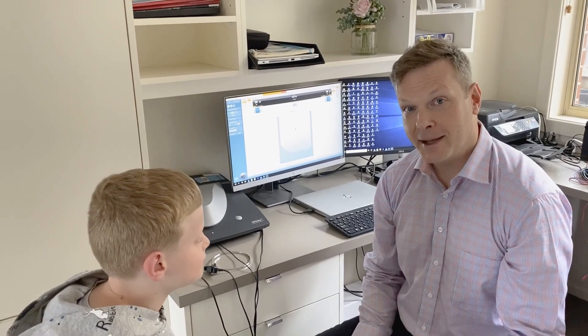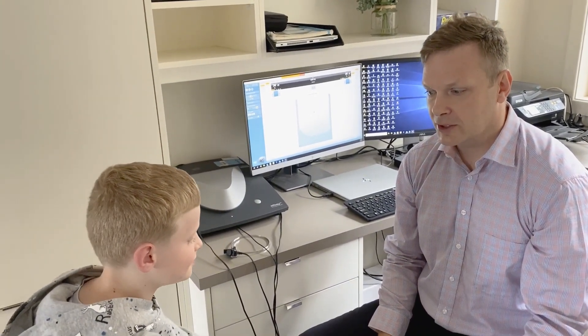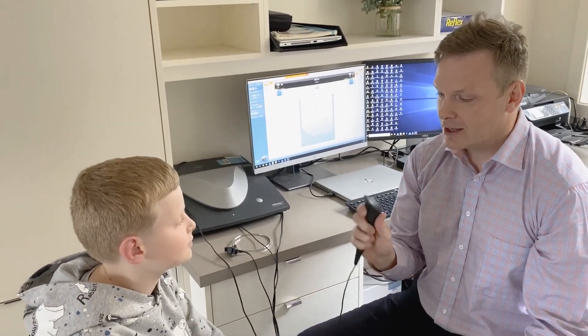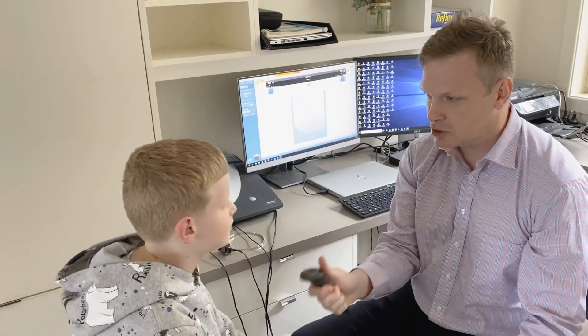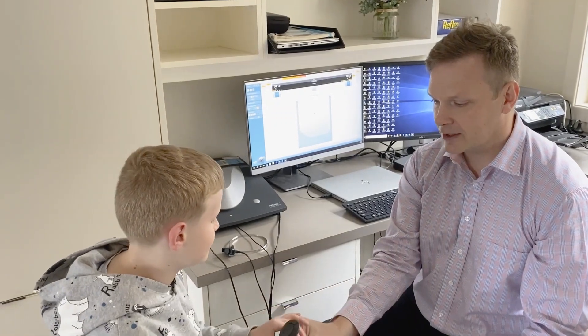Okay, so we've got our patient here. This is Bailey and we're going to do a hearing test today. This is the presentation button — it's a little button that you can push. What I want you to do is push the button as soon as you hear a sound, even for the very soft ones.